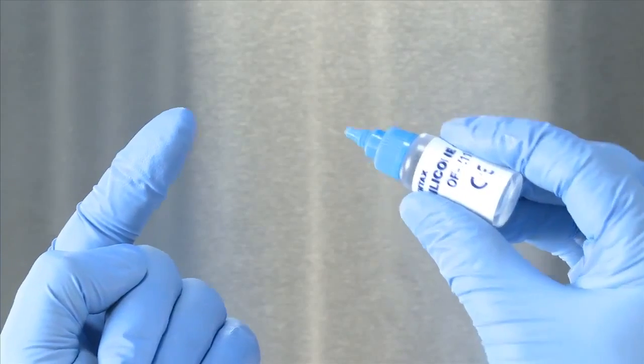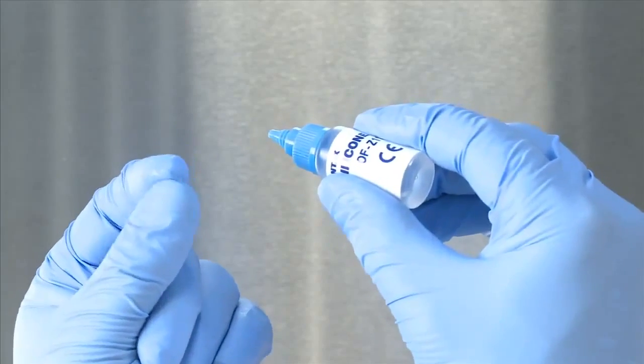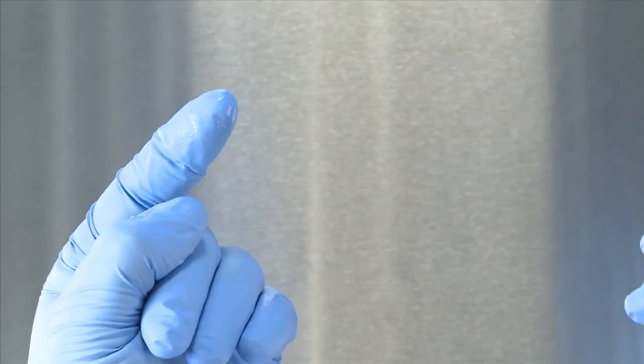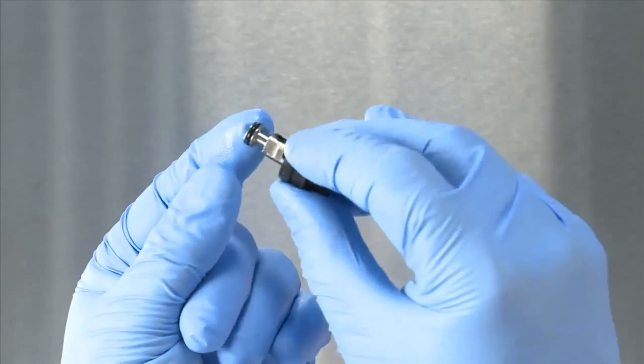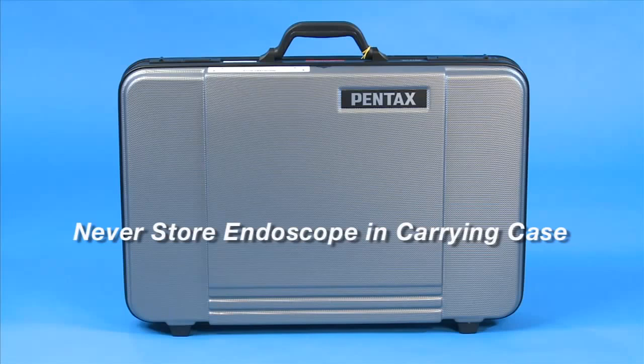To ensure that the O-rings are kept pliable, apply a thin coat of PENTAX silicone oil as needed. A good way to keep the valves well lubricated is to dip the O-rings into sterile water before attaching to the endoscope. Caution: never store the endoscope in its carrying case and avoid exposure to direct sunlight or X-rays.